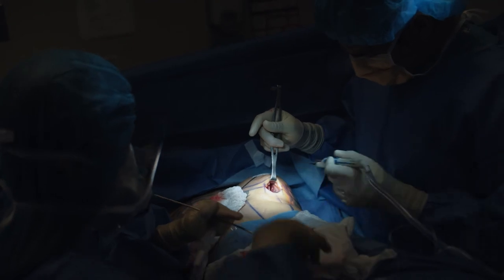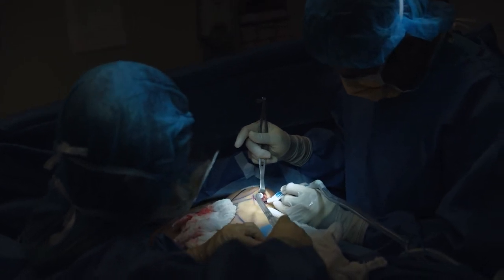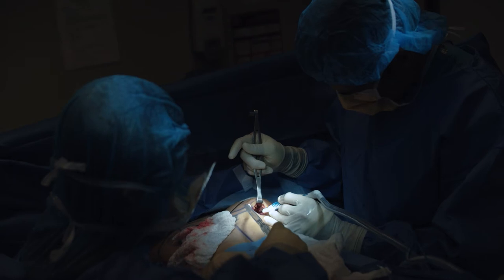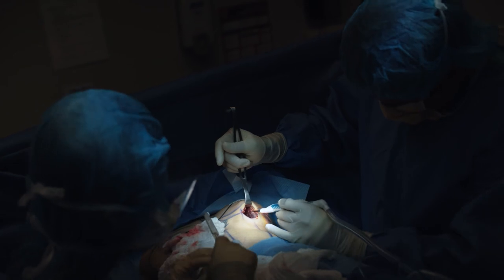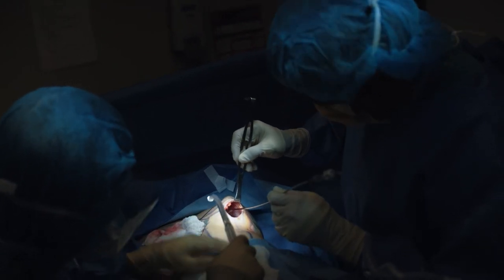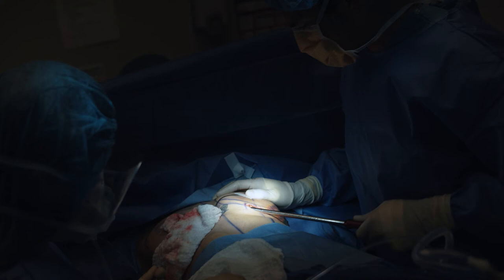Now we're going to release the muscle. We're releasing the muscle now. Create maximal cleavage.